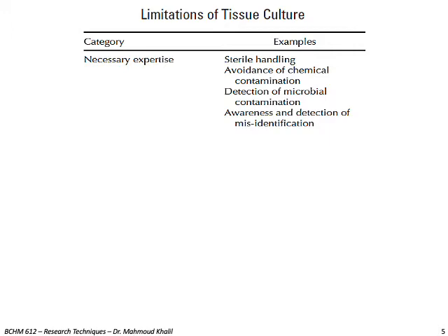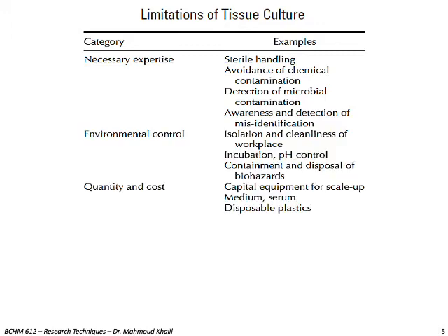But there are some limitations for the use of tissue culture. First thing is the necessary expertise. So scientists need to work on the cell culture. They need to understand how to do sterile handling, how to avoid chemical contamination, how to detect microbial contamination, and be aware of cross-contamination and misidentification.